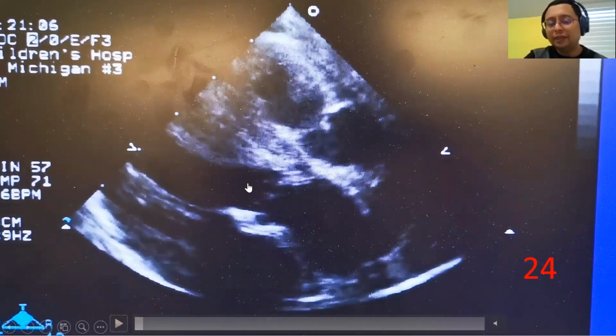Okay, you can see in this patient, this is the pulmonary valve, this is the aortic valve. They have actually changed place. The pulmonary valve is actually coming from the left ventricle, and the aortic valve is coming from the right ventricle. Okay, how do I know it is the great vessel that is changing, not the ventricle? It is because there is preservation of the mitral aortic curtain. This is preservation of the mitral pulmonary curtain in this situation. Okay, so aorta is at the front, pulmonary is at the back. It is actually coming from different ventricles.